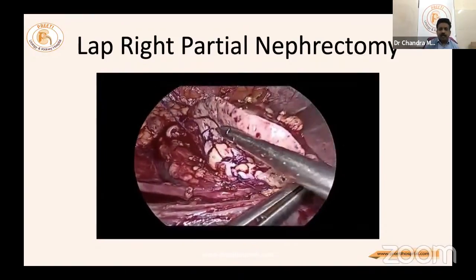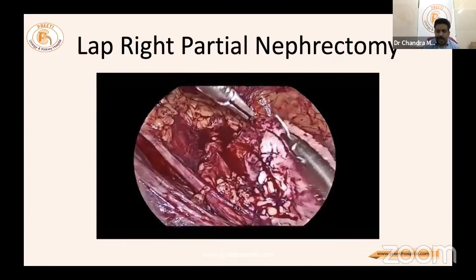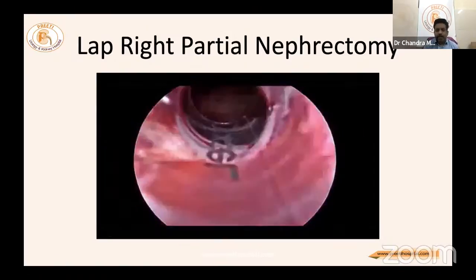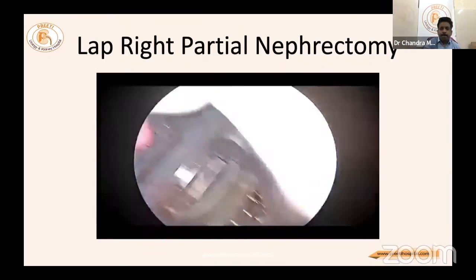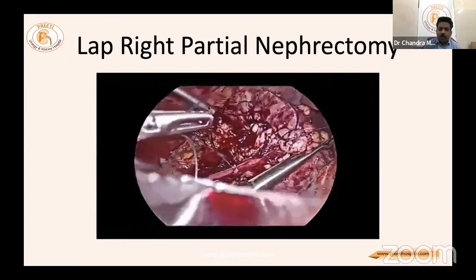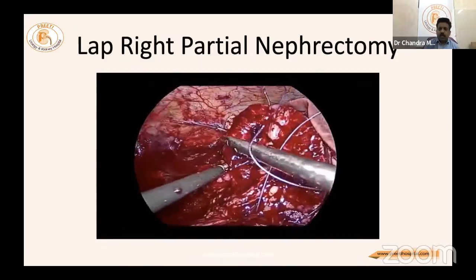The inner layer is sutured and once complete, the outer layer can be addressed directly. This is a one-year-old video — in present practice, the outer layer is not sutured. The clamp is now released. Everything is kept ready before releasing. After clamp release, coagulation of the parenchyma continues, and any inner layer that is bleeding is sutured.